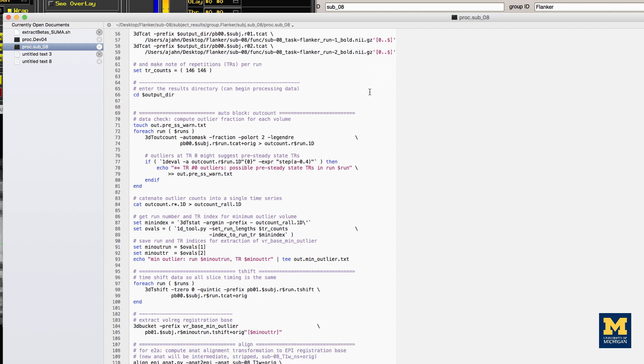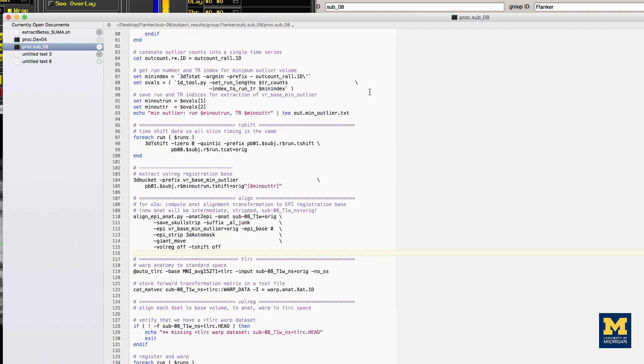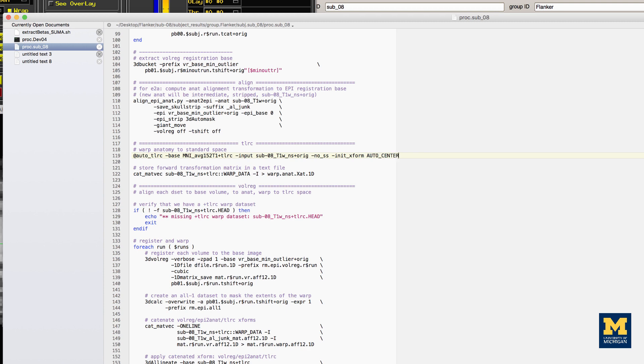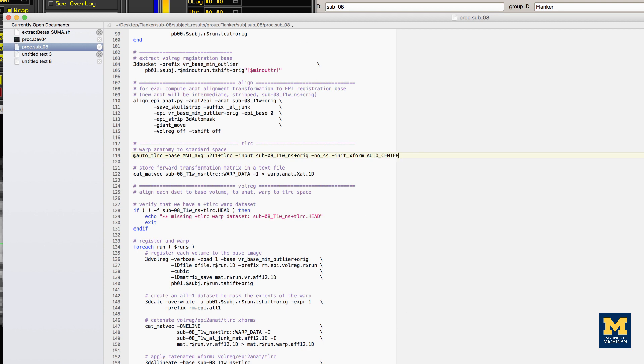Here I'm opening the file in text wrangler. We then locate the auto_tlrc command, and we add the additional option -init_xform AUTO_CENTER. Save the file and rerun it by going to the terminal and typing tcsh proc.sub_08.